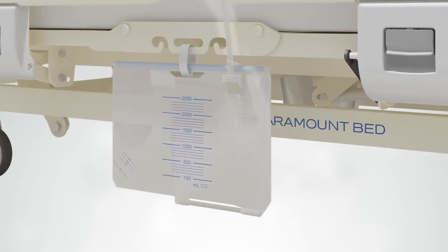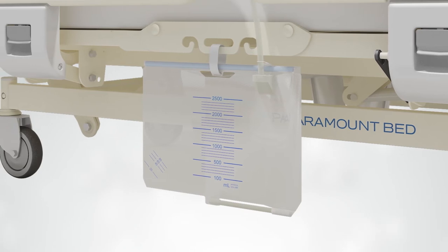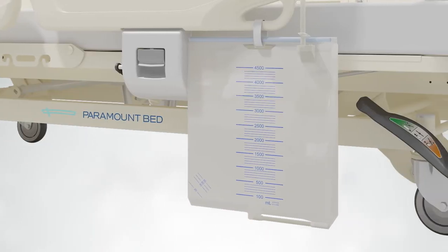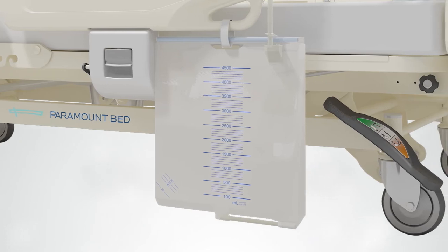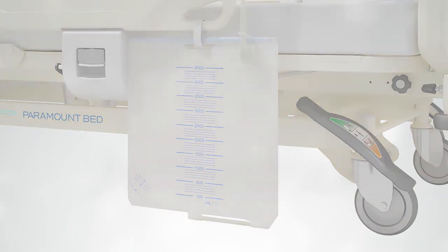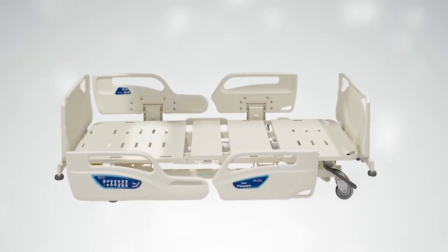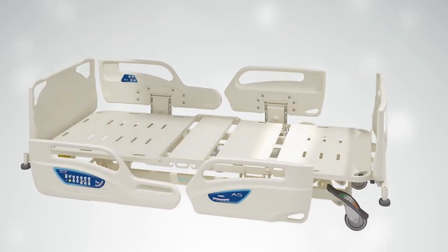Accessory holders are located at hip level on both sides of the patient bed, for medical personnel to conveniently hang items such as urine bags and other items needed for the patient's condition. The bottom of the bed is flat, allowing maintenance staff and medical personnel to easily clean it.